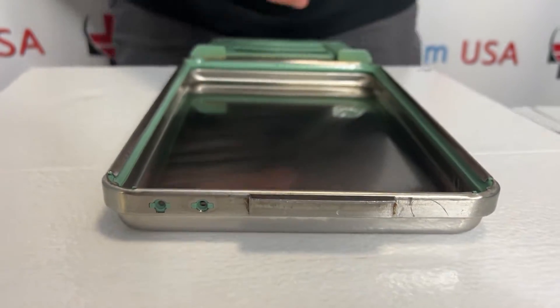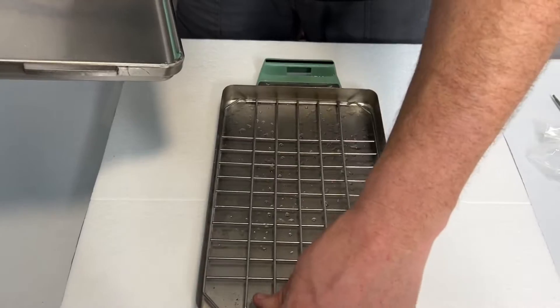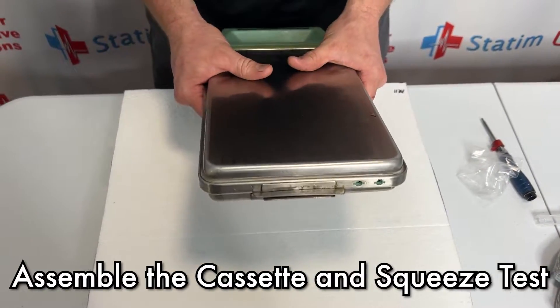When you run a cycle, there will be residual water that sticks to the lid — that is because of that lubricant. You can use Stat Dry to help get rid of that water faster. Last thing I'm going to do is put the cassette together and give it the squish test.